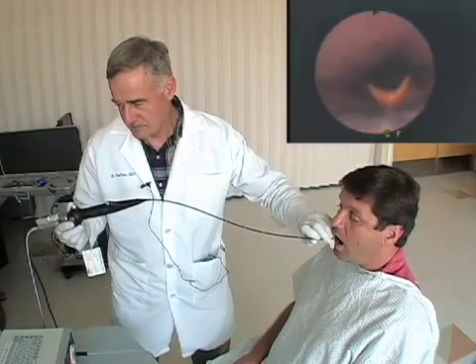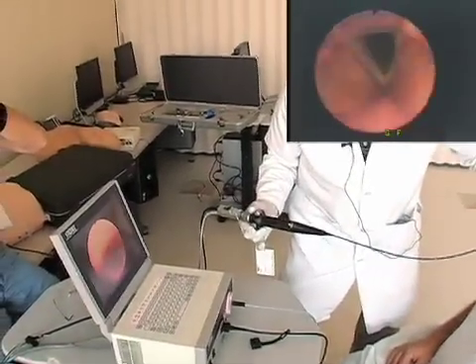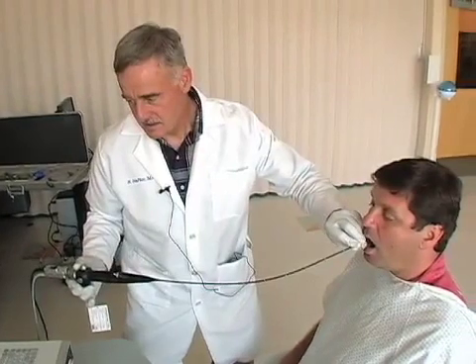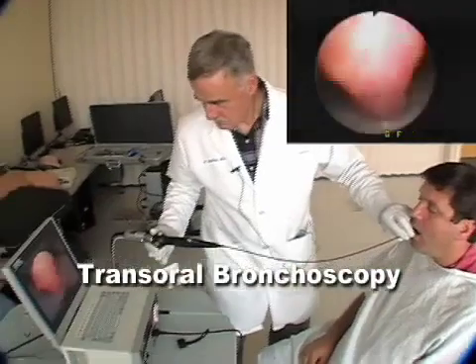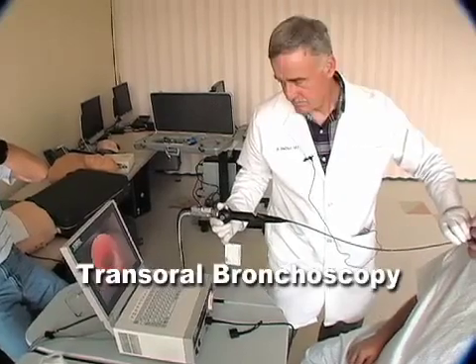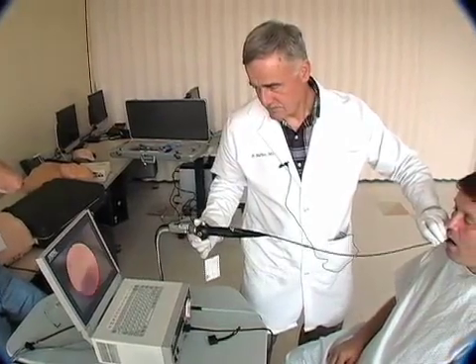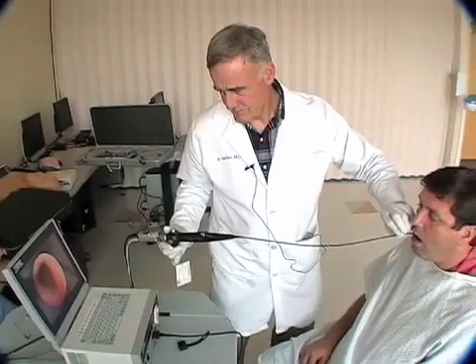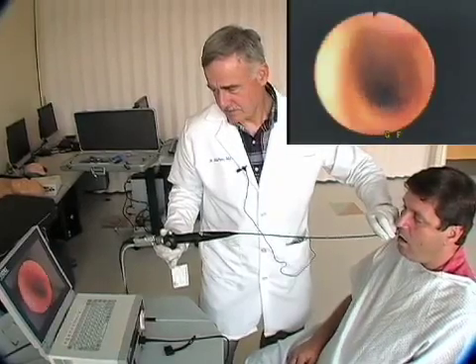Just breathe in and out deeply. Say E. The uvula — that's the uvula. There we are, going all the way down.